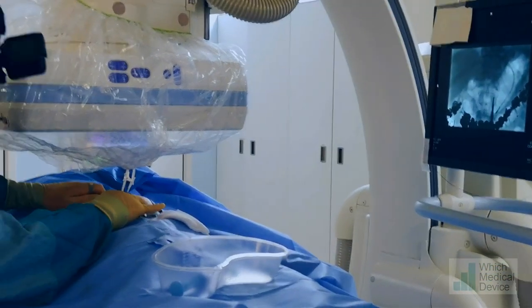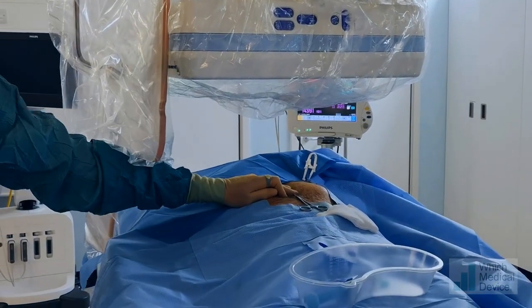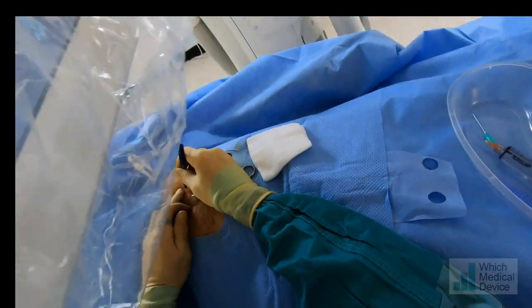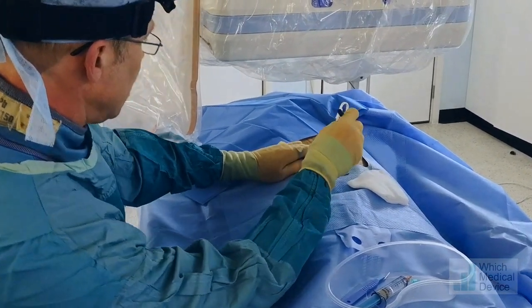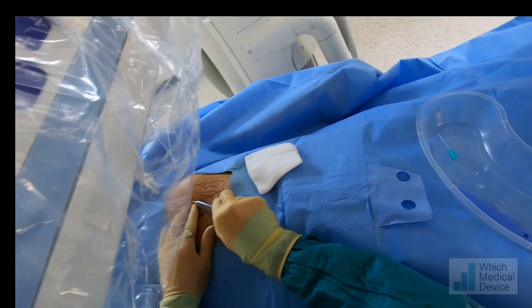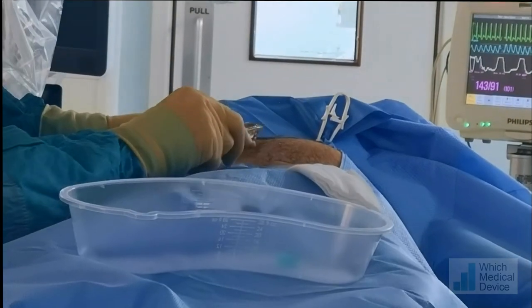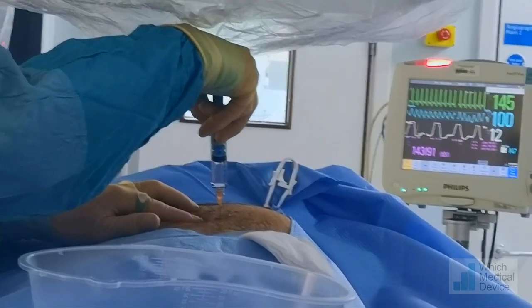I'm going to feel on your skin and make some marks. We're going to place one T-fastener there, one T-fastener there, and one about there. These are our gastropexy positions. There'll be a bit of a sting — injecting that nice and slowly.